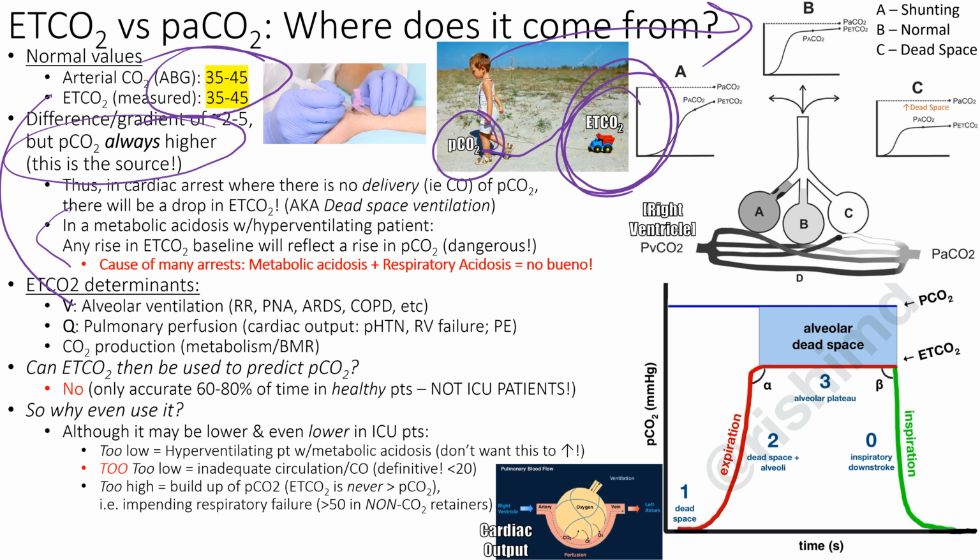Mixed acidosis. So that's why it's important to have end-tidal CO2 also on your cardiac arrest patients, even during arrest, as we'll point out. During arrest, you can see if they're getting good CPR or not. You can see immediately if they got ROSC, and you can stop all compressions once you see that you got ROSC on the end-tidal CO2. Okay, so yeah, that's a very common cause of cardiac arrest as well.